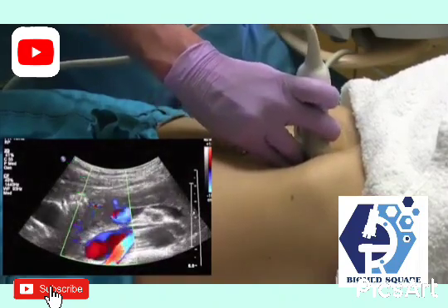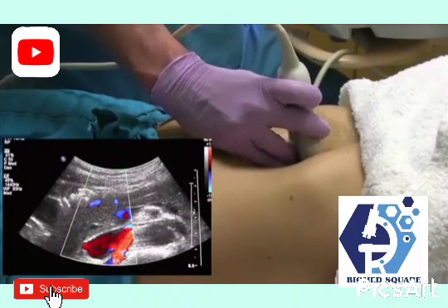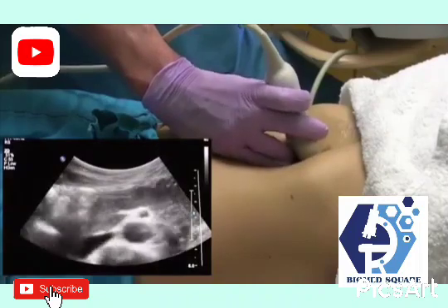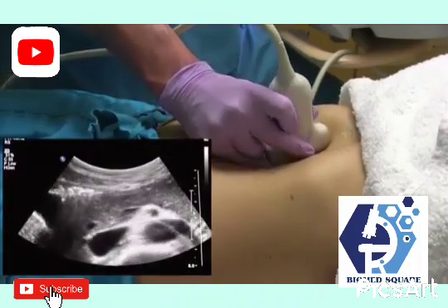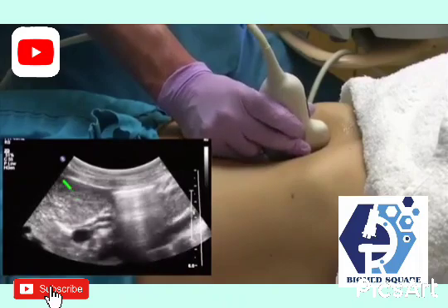And then in the posterior head of the pancreas, you'll probably be able to see the CBD if the patient is a good scan. Alright, and if you find the CBD, you can also turn sagittal to the CBD from this position and elongate it as it goes into the liver.